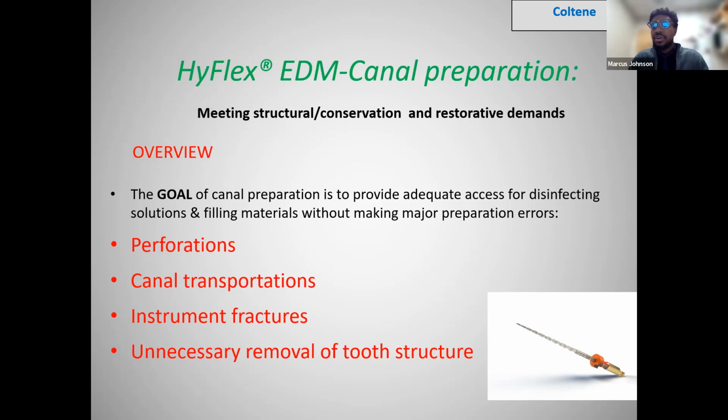And we're going to talk about some new file innovations, but not too much. But I think that if you are doing endodontics, and you really should be doing endodontics, it's just a great time to practice the art and science of saving teeth. We see that there are so many new advances within files, whether it's regressive taper, smaller diameter, controlled memory, increased flexibility, resistance to fracture, things of this nature, which really allow us to maintain the natural shape or the natural anatomy of the tooth, but also to remove less of the pericervical dentin. And we'll get into that and discuss and dissect the hierarchy of tooth materials and how we go about assessing that.